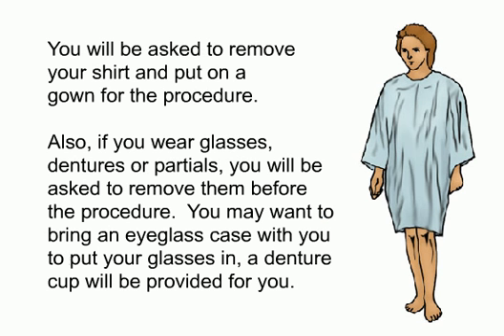You will be asked to remove your shirt and put on a gown for the procedure. Also, if you wear glasses, dentures, or partials, you will be asked to remove them before the procedure. You may want to bring an eyeglass case with you to put your glasses in. A denture cup will be provided for you.